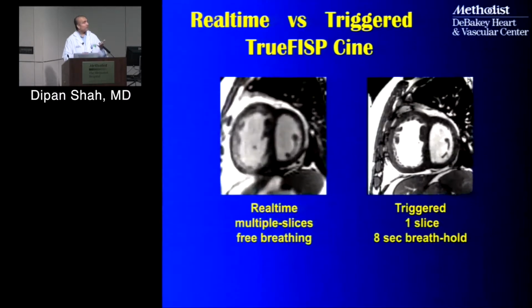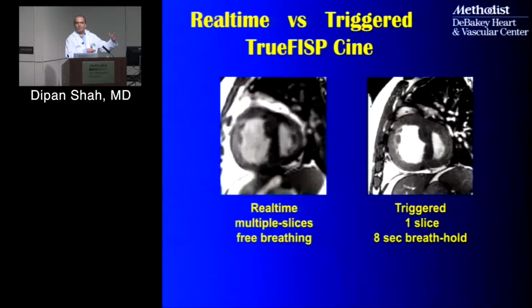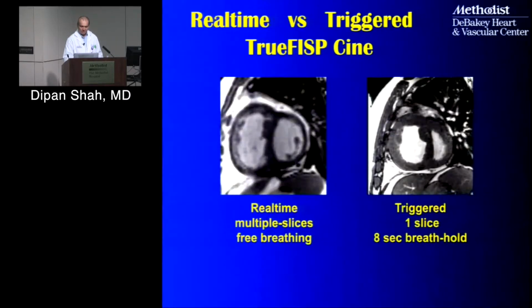And then you can always change that, because there are other tricks I can do where I can go to higher levels of acceleration to improve my temporal resolution at the expense of slightly worse signal to noise. So there are different things that you can do for each given scenario.